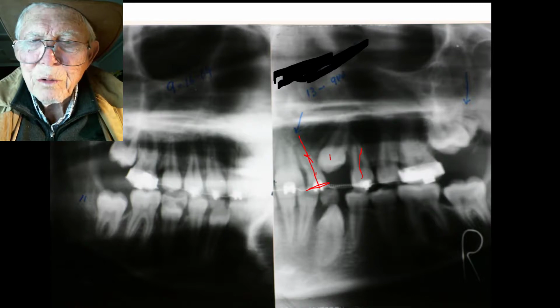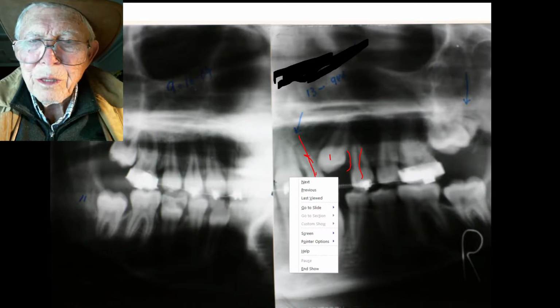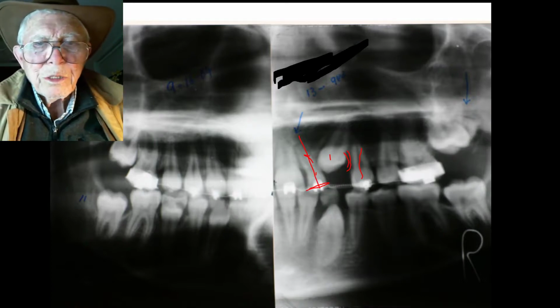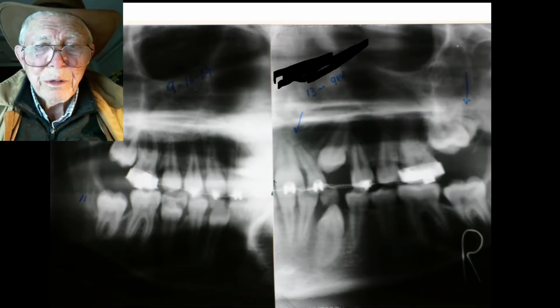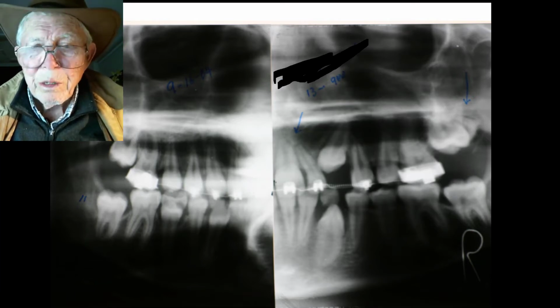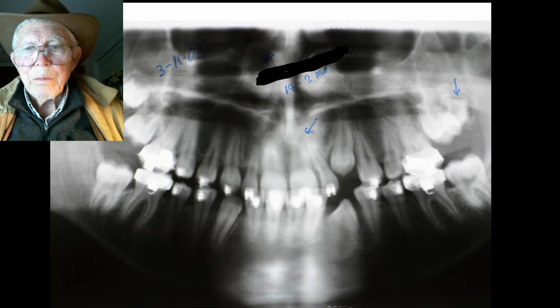And now this follicle apparently has broken to the outside, and the thing has gotten smaller. You see, it's not as big as it was. This cuspid is in place on the other side of the mouth. Now the cuspid's coming through down here, completely rotated, and that's just regular orthodontics, I'm not going to get into that now. So here we can come in now and expand that wire a little bit and then squeeze that cuspid right into place.